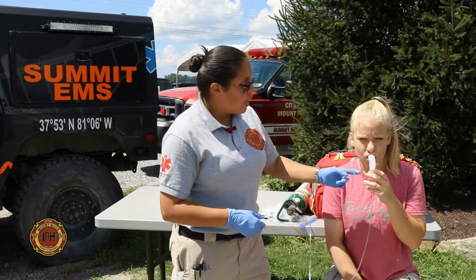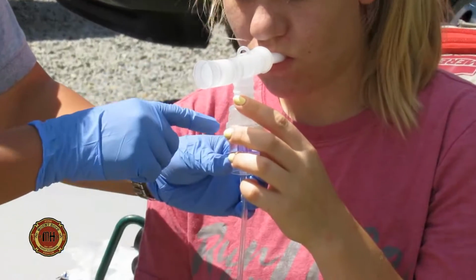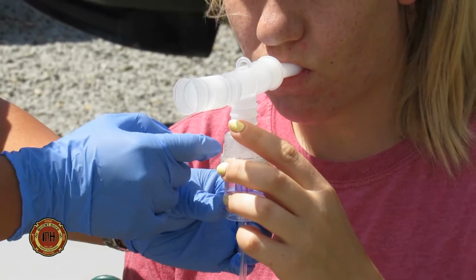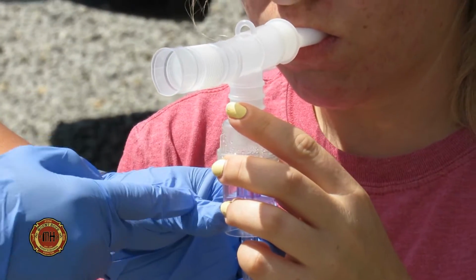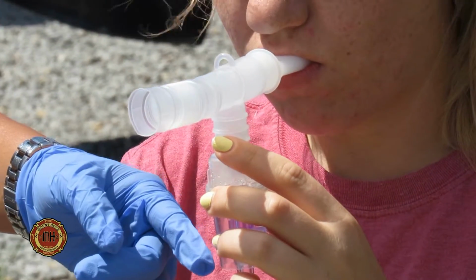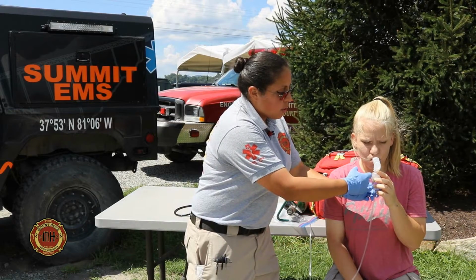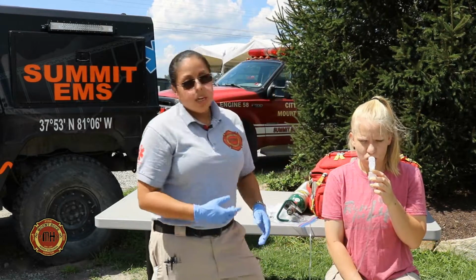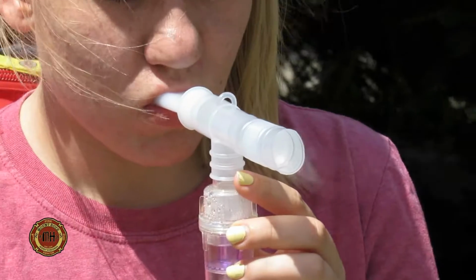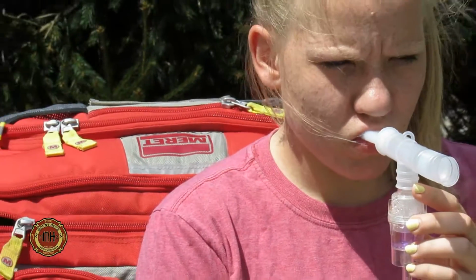As you can see, the medication is aerosolized. And so there are these particulates in here. And so you want to make sure that the patient is getting all of the medication. And so as this medication starts to get used up, you just want to make sure that these little particulates get knocked down so that way the patient gets the full dose. You want to make sure that you listen to their lung sounds and monitor their vitals.